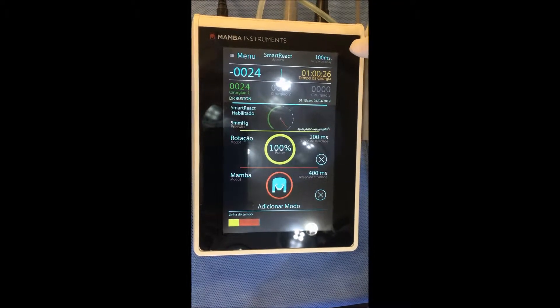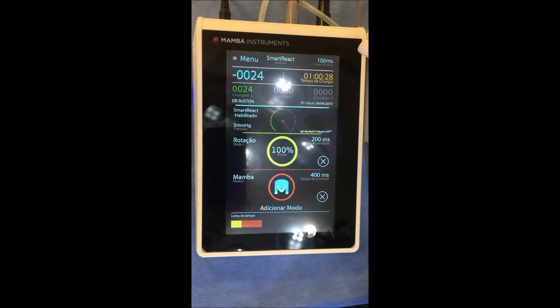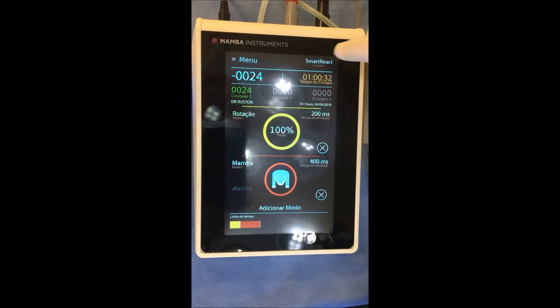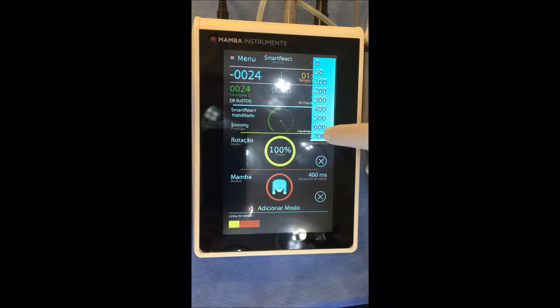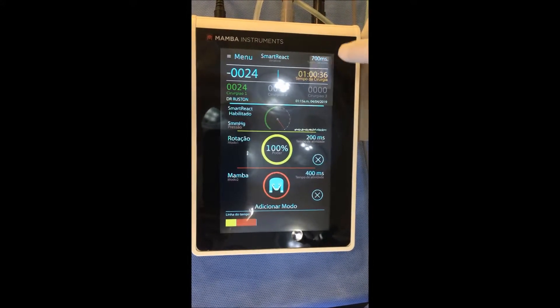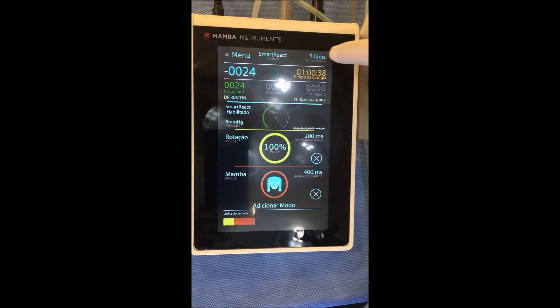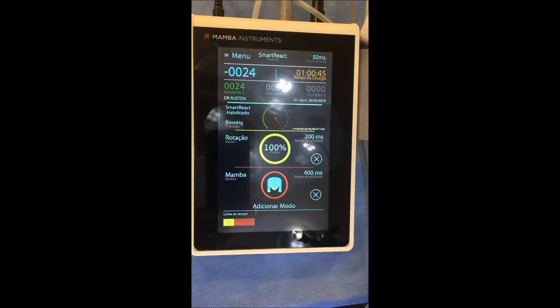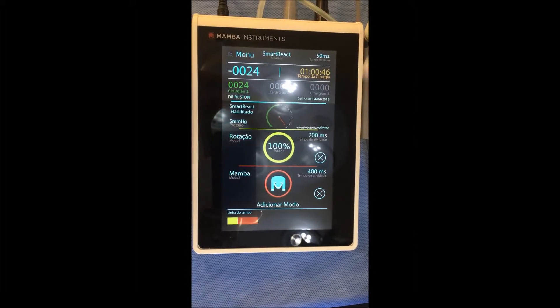As you gain speed and accuracy, you can change the pedal to smart reaction, and you can decrease the smart reaction time. For example, start with 700, then go to 500, then 300. I personally use 50 milliseconds — that's almost where a touch starts the rotation.